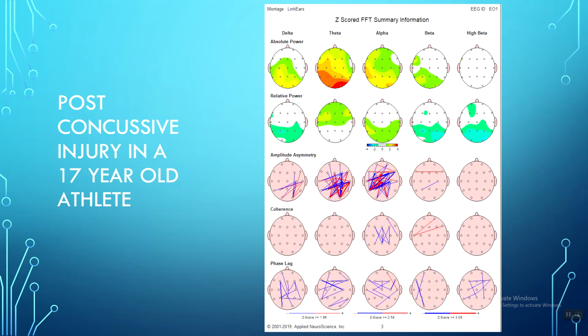Now, in the case of a head injury that has a lingering functional deficit associated with it, it's like the emergency trucks never left the front driveway, or the street outside the front of the house. So there's a traffic jam, and it's just preventing the moving on. Right, so that's our job. Once the brain has done its own work after a head injury, which is a minimum of 6 weeks post-head injury, depending on the severity, then we can start to move some of the slow waves out of the way.